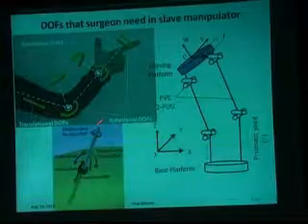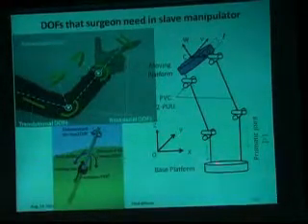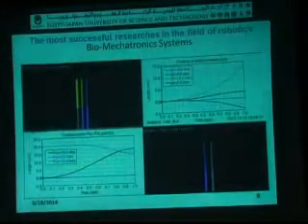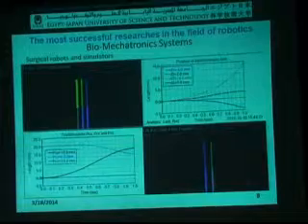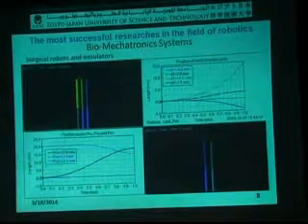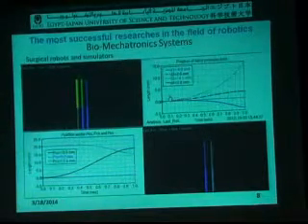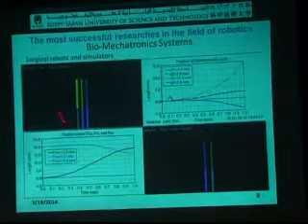First of all, we have to imitate the motion of the hand. So this robot can do 6 degrees of freedom of the hand like this. And our robot consists of 4 arms. This is 2 and this is another 2. This is the kinematic structure of the robot. Of course, we did a lot of calculation, and finally we did some simulation work to find the bending angle here.